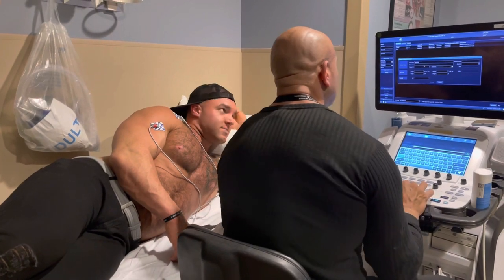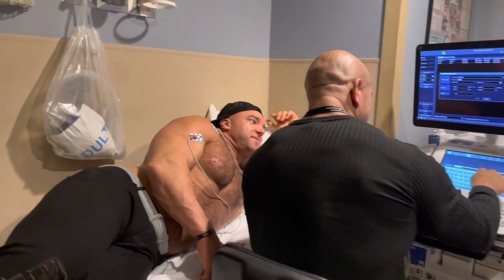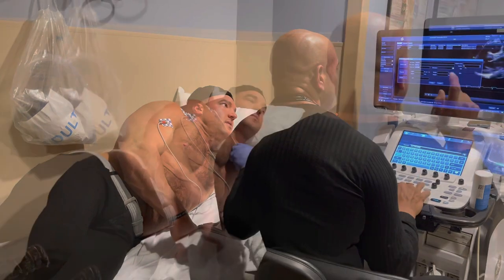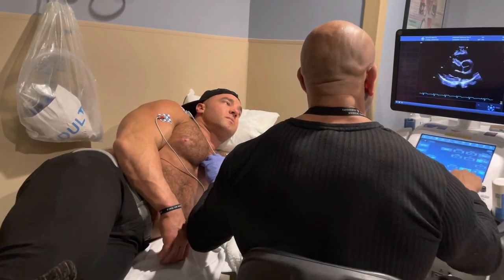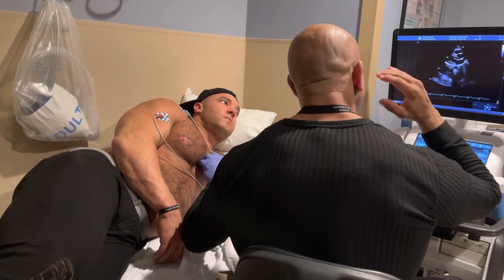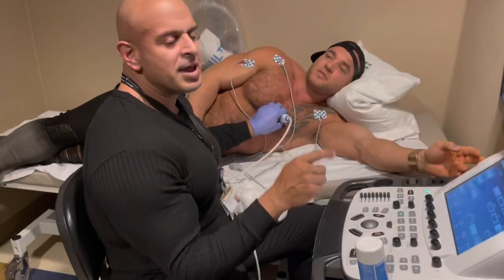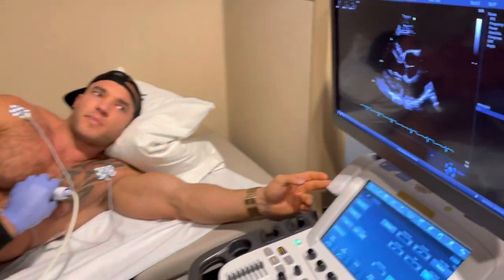Just two buff people checking on his heart — checking the little kicker. This test doesn't show blockages. It shows the inside of your heart. This is an echocardiogram — an ultrasound of his heart. So this is just a cut from the inside.